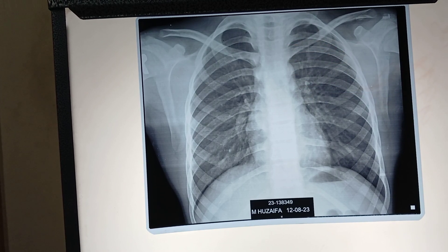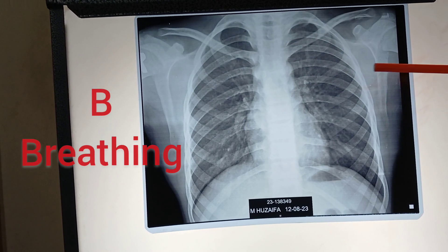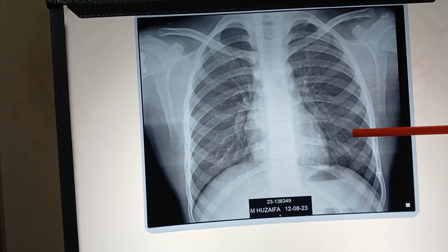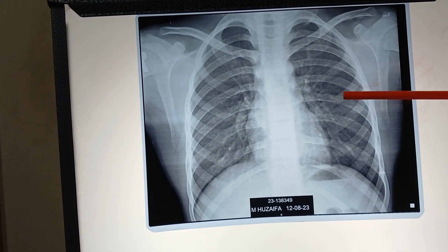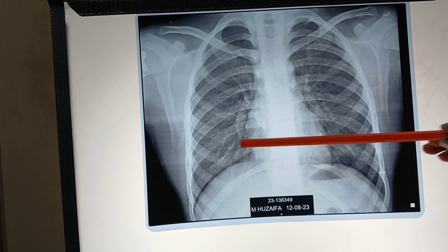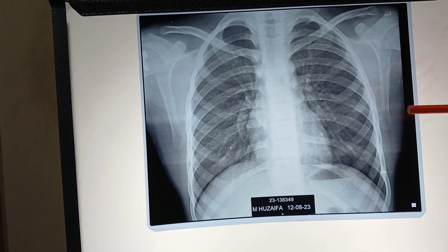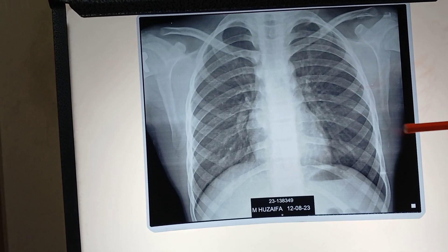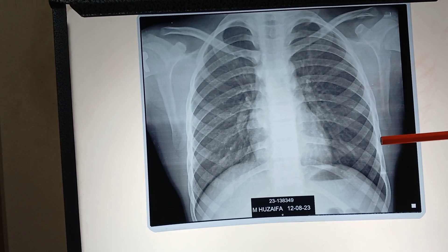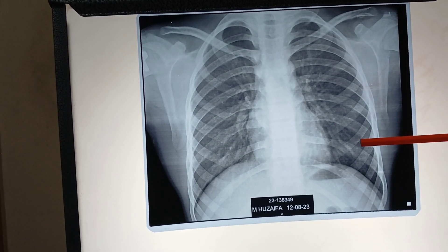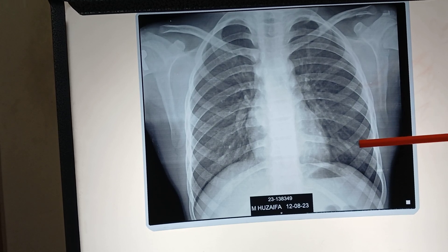Next is B, which means breathing or bones. Breathing means lung fields. The lungs contain air and the air looks black. If there is any disease such as consolidation or pleural effusion, then the air is replaced by fluid. The fluid is seen as white, which is termed opacity.